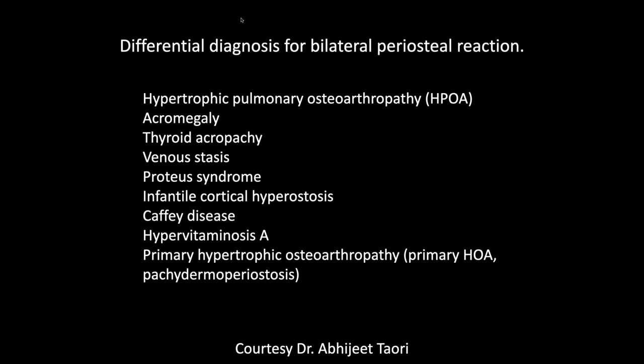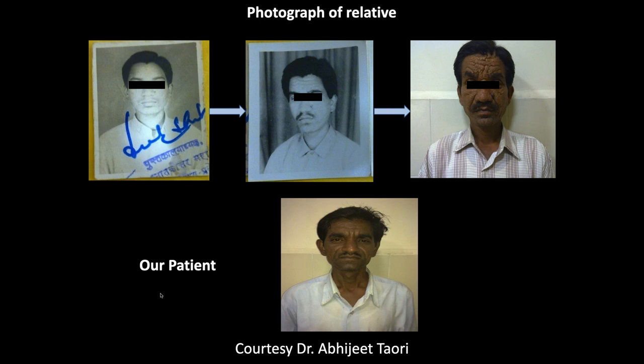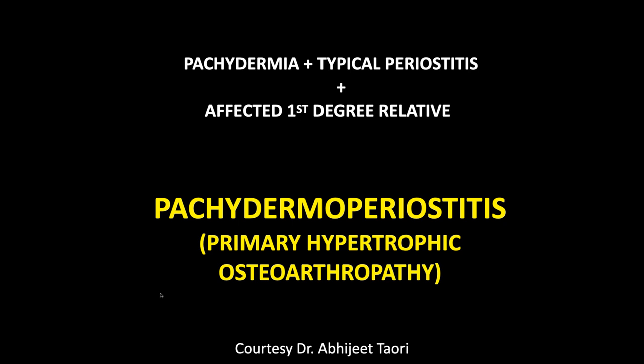It's a different case, but it's the same diagnosis. So with all this periosteal reaction and so forth, there's a pretty big difference. Is it some hematologic disorder? And then here's his brother, and this is pachydermoperiostosis. But basically it looks like a congenital syndrome, and so you'd have to then go through it. And the problem now is, when I was in medical school, there were only a few congenital syndromes. Now there are probably thousands, maybe even many more than that, because now you determine them not so much by their clinical presentation, but by their genetic makeup.